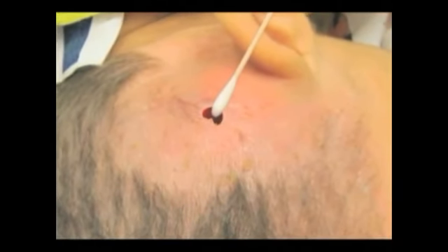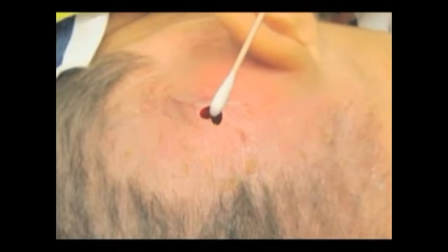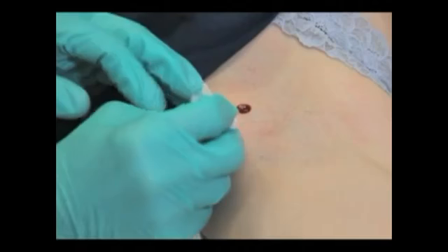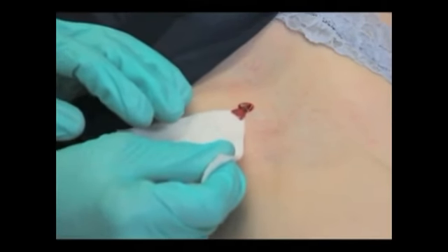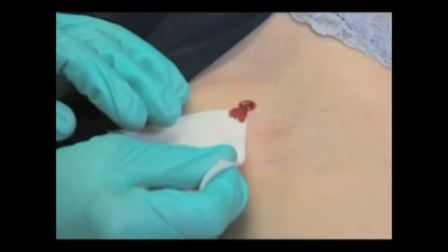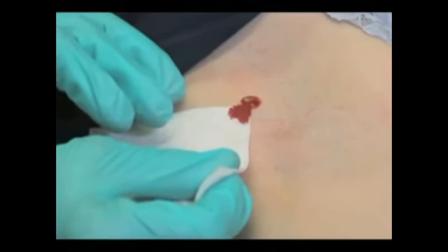On the scalp, bleeding may be brisk. The assistant can occlude the punch defect with a cotton tip applicator so the surgeon can visualize suture placement. Alternatively, place the corner of a gauze at the punch defect. The gauze will absorb the blood flow by capillary action, allowing for visualization for suture placement.